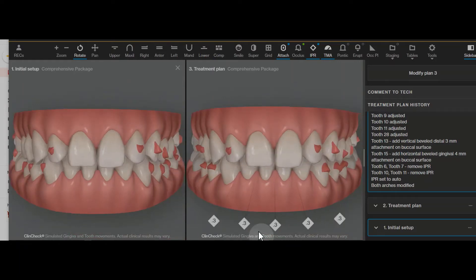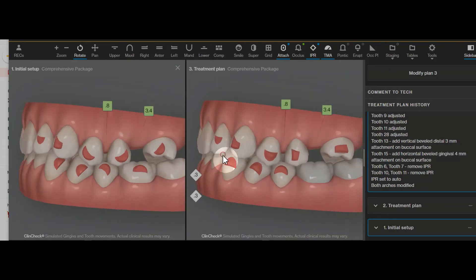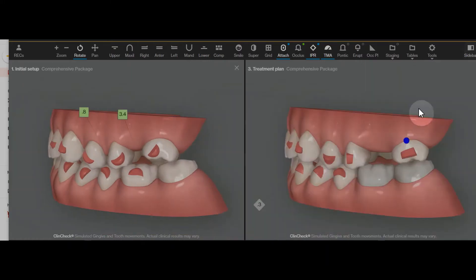I would go one week per aligner, or if the patient is using a munchie really well, you could do five days per aligner to start this initial phase of movement. I always move the molar first, because once this tooth gets into a better position — and I really over-treated it — these molar teeth are multi-rooted and they can lag behind slightly.